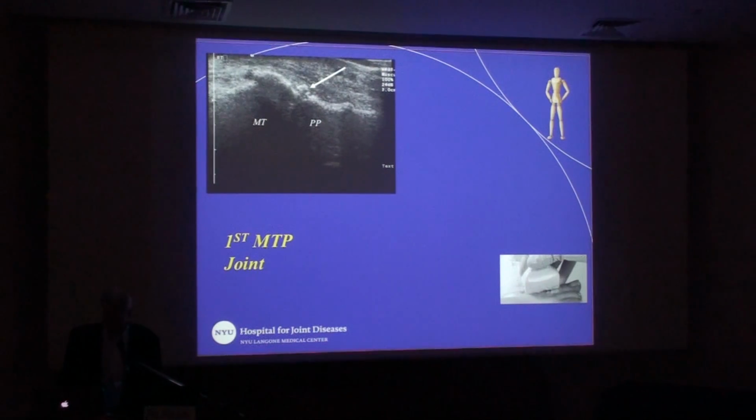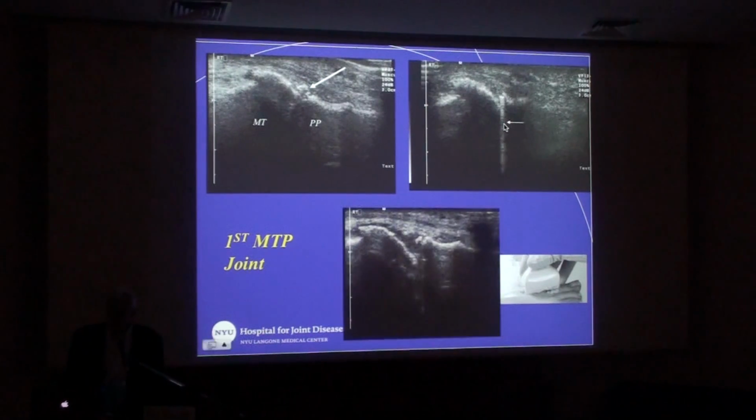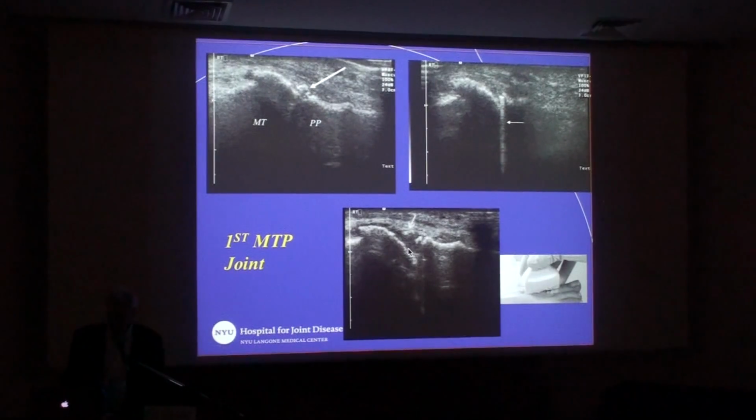Patients come in with arthritis in the great toe due to hallux rigidus or a bunion deformity. And so this is what that would look like. So here's the first MTP joint, a joint body situated over here, first metatarsal, proximal phalanx. Here's my needle sitting in, that I placed in short axis, so you see a characteristic reverberation artifact, so we know it's due to metal. Then I've done my injection, and you see the extension of the dorsal recess that is indicated by this arrow over here, and you see the low-level echoes within the distended dorsal recess due to the contrast effect that we mentioned earlier.